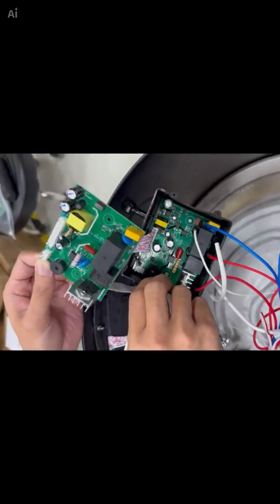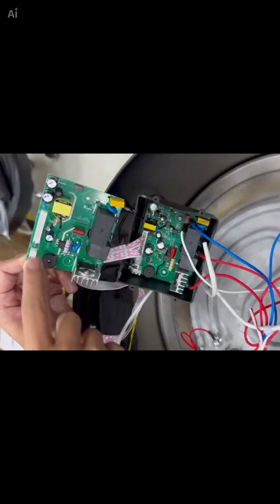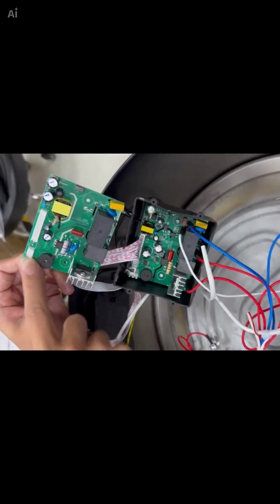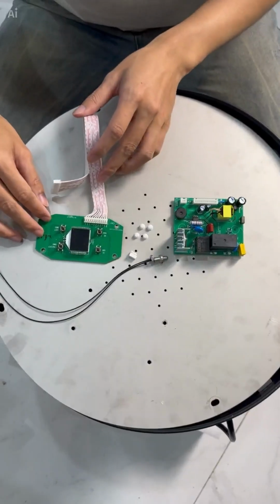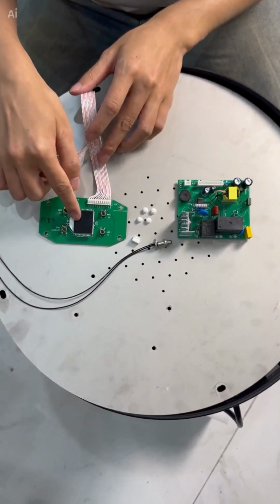And then there is also this ribbon cable. Unplug it and plug it in here. So these 2 wires, after unplugging, plug them in here and there will be no problem. See, the key is to unplug one and plug in one. This time we are mainly replacing 2 boards, 1 power board and 1 display board.